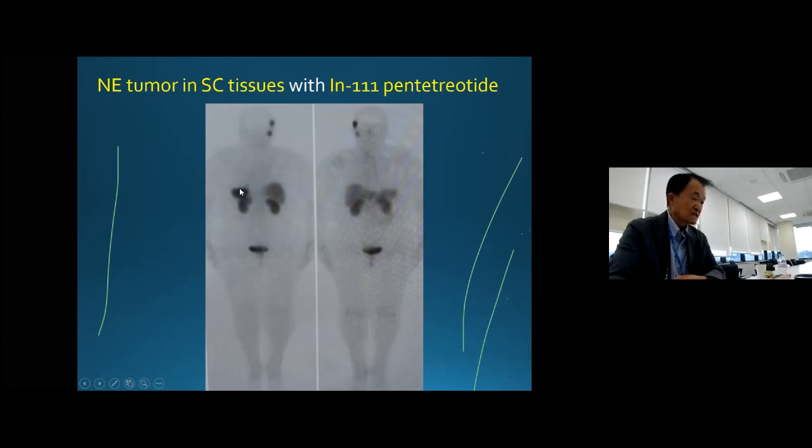When you have an intense spleen, you can think about labeled white cell, red cell, or platelet, plus this octreotide somatostatin receptor imaging. The leukocyte should not show, and red cell should not show this kind of intense kidney activity.